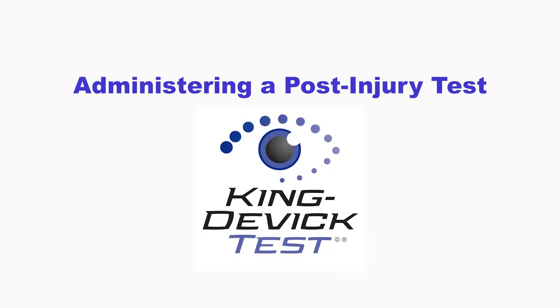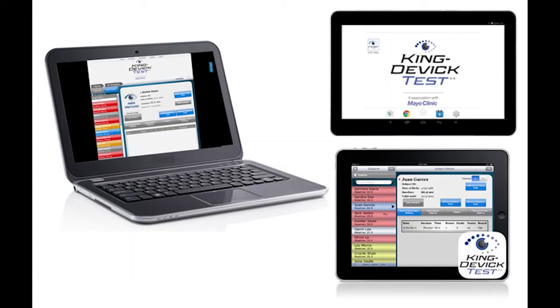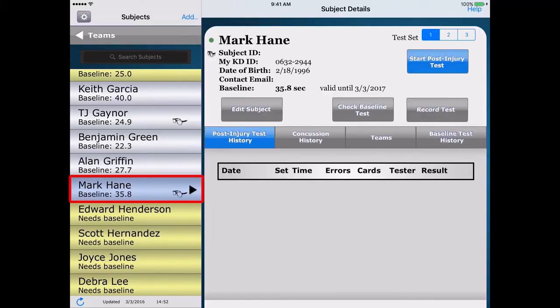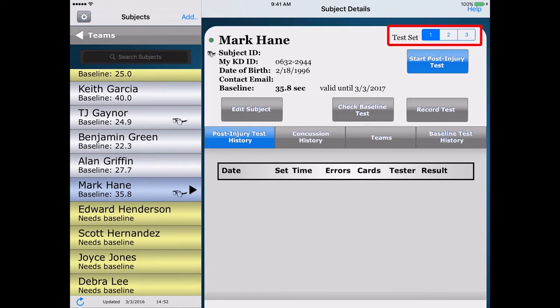Administering a post-injury test: A post-injury test is a test administration following a suspected head trauma. The KingDevic test app allows you to administer a post-injury test directly on the iPad and sync with your KDTOS account. Select the subject from the subject list on the left column, and the subject's profile will appear in the subject details on the right. Select the test set and press Start Post-Injury Test.